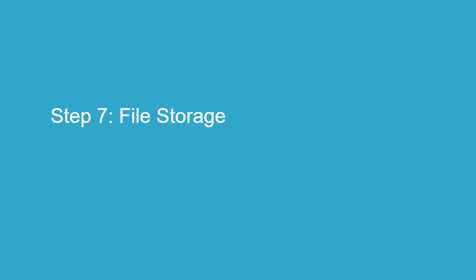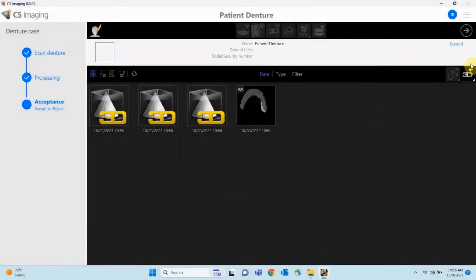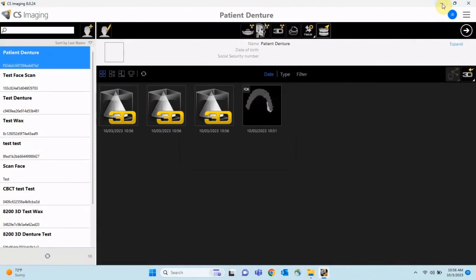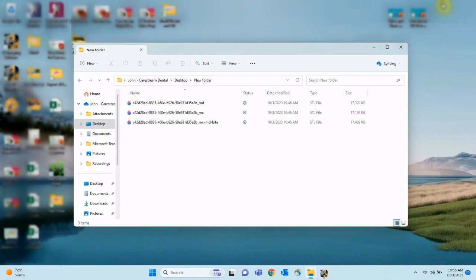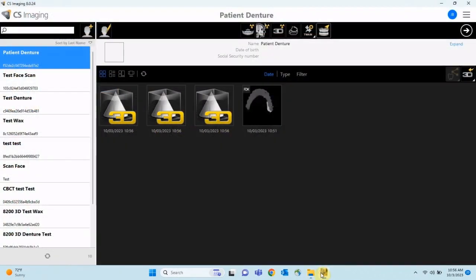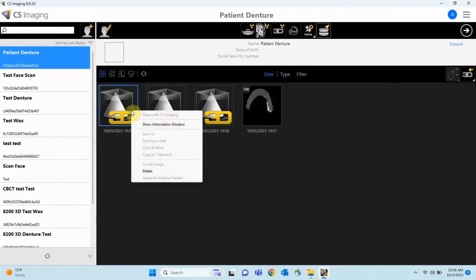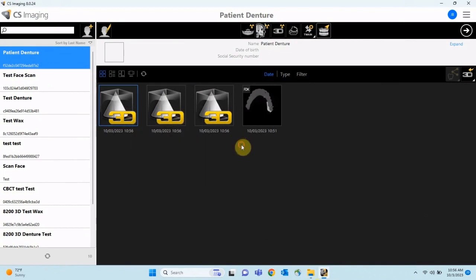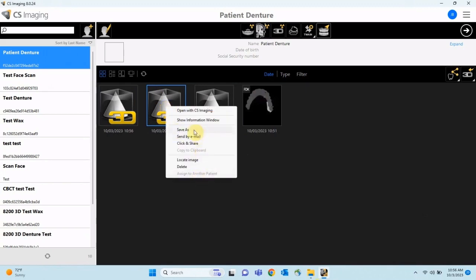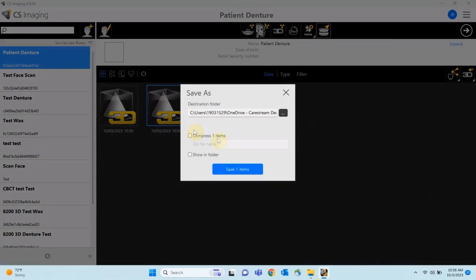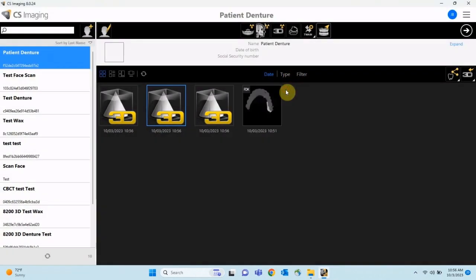Step 7: File Storage. After the scanned denture has been accepted, it is automatically stored in the CS Imaging software. The STL files are labeled maxillary and mandibular. If a bite registration is present, a third STL file is stored and labeled maxillary, mandibular, and bite registration. This third STL is a combination of all three scans: upper, lower, and bite registration. Files can be saved locally by right-clicking and selecting Save As, then choosing an appropriate location.